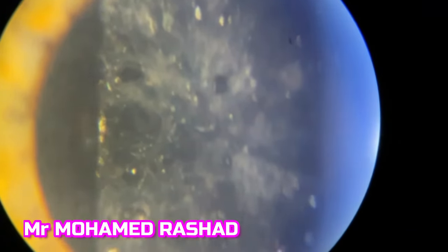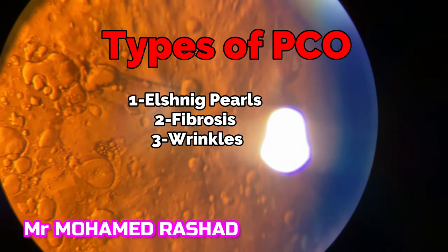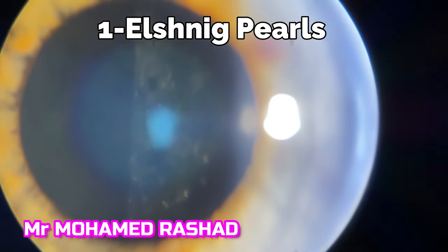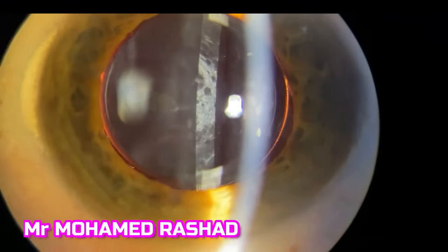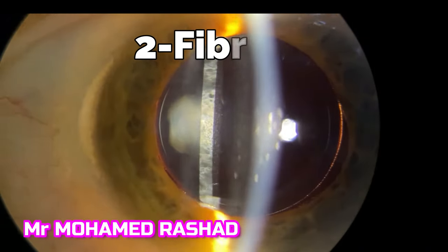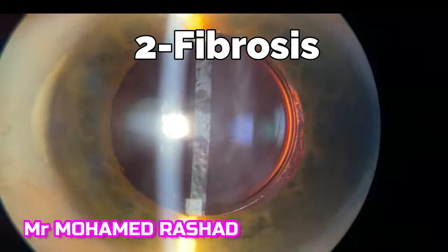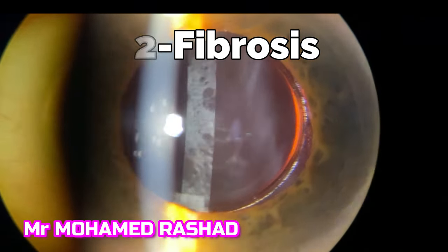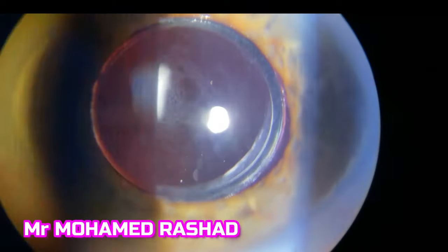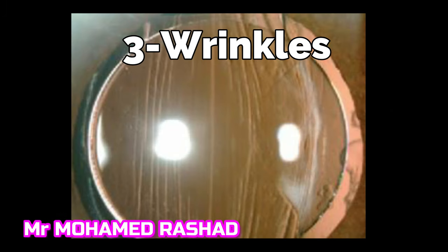Under higher magnification you can see the opacity of the posterior capsule. There are three types: Elschnig pearls, fibrosis, and wrinkles. The Elschnig pearls type is the easiest one to start with — it is proliferation of lens fibers. The second type is fibrosis; in these cases vision is not deteriorated much but there is more glare, and the capsulotomy opening will not be ideal — these are difficult cases. The third type is wrinkles. I advise starting with Elschnig pearls as it gives the easiest and best results.